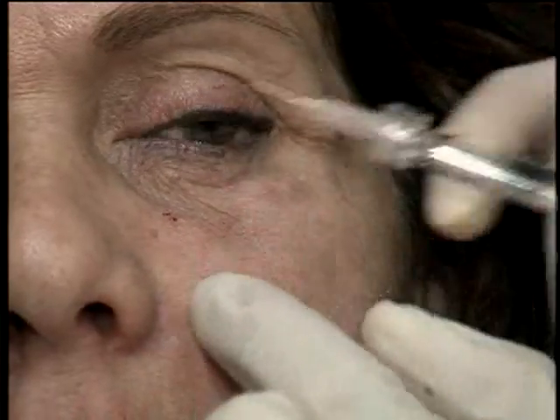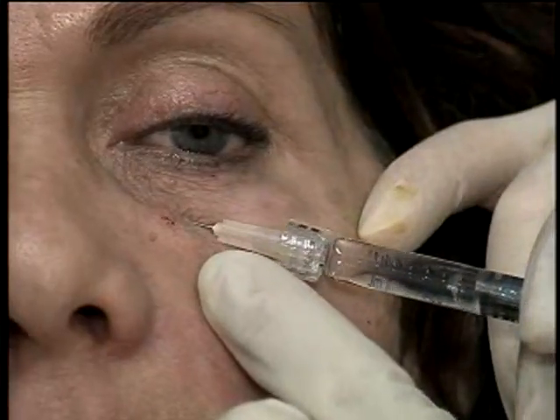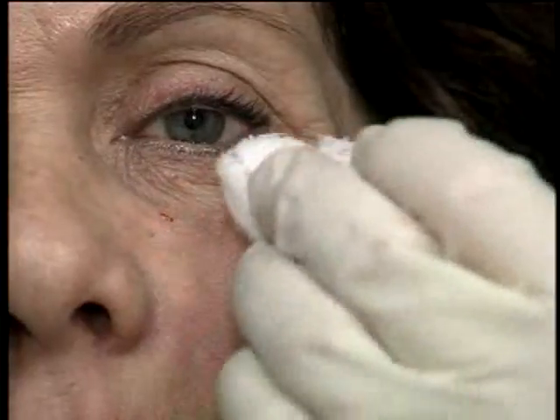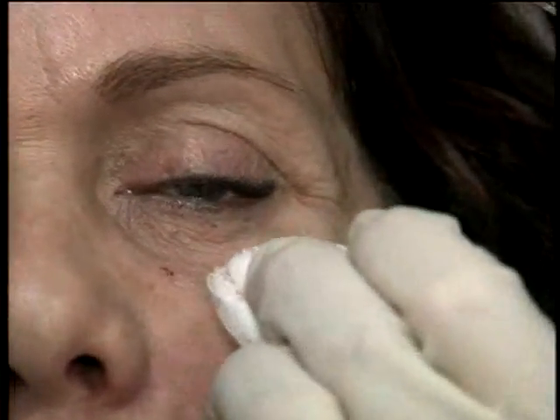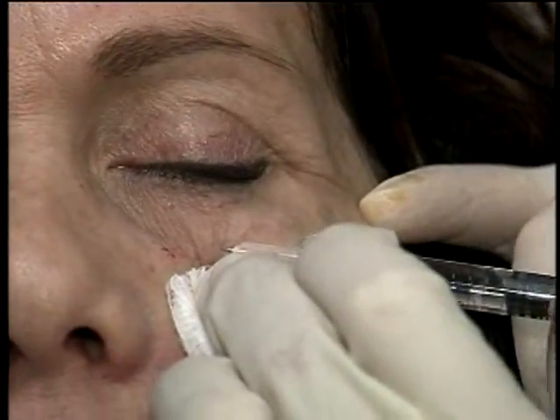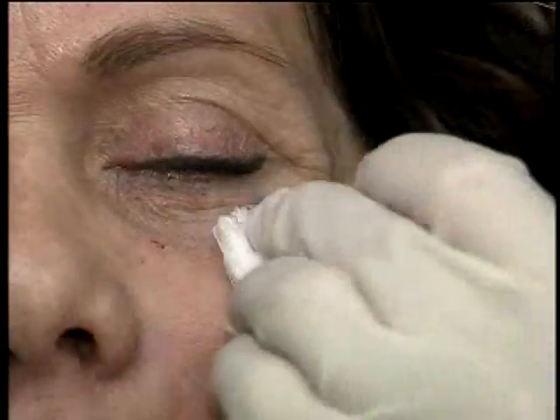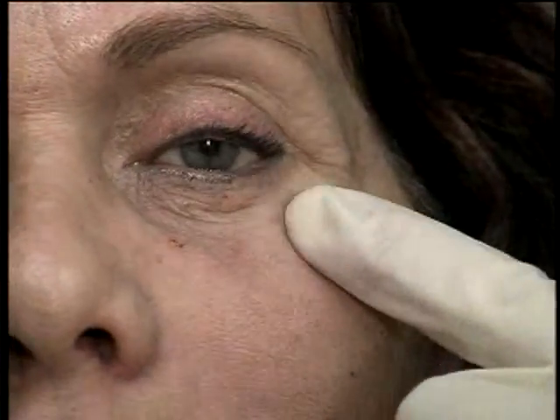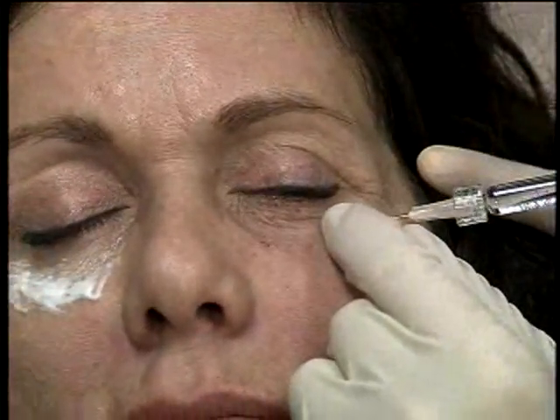Deep. Now some people will do a very thin layer just underneath the orbicularis like this, and just lay little whispers of product down. I don't like doing that. I think it leads to little blue blebs, but it's an option to just go real superficial underneath orbicularis and just deposit a little bit. So that's an option, but I don't do that. And that's it for treating around the eye. I undercorrect. Actually, I think you use a little bit more right there.